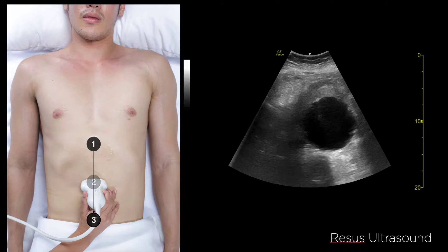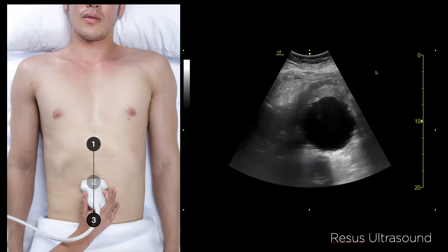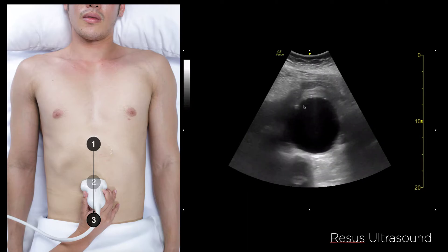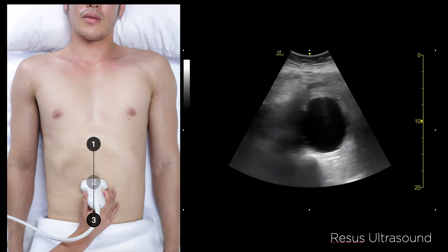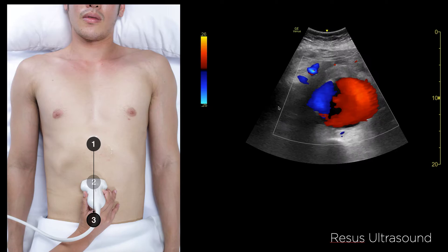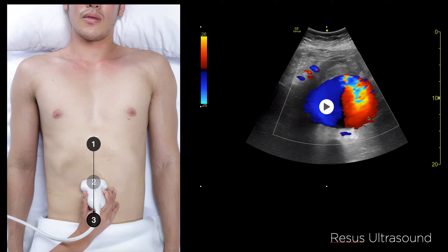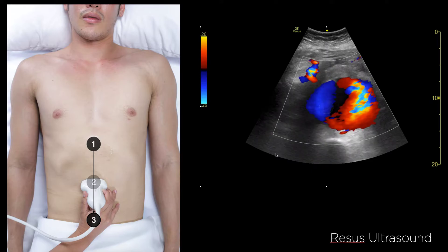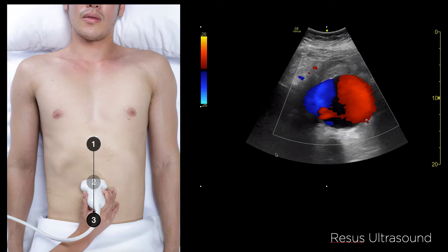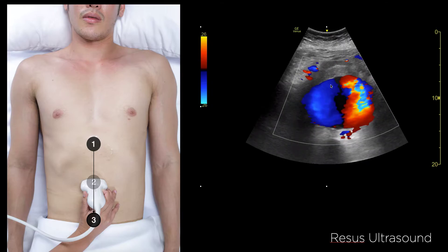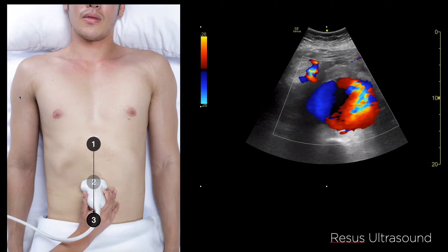Then move down to the umbilicus where normally the aorta splits into the iliac arteries. This is a showcase of our patient who obviously has a large Triple-A. You can see this cystic structure — it's round — and there's something slightly hyperechoic here. When you apply color Doppler, because of turbulent flow, the blood travels in opposite directions, so you see one half blue and one half red. This confirms Triple-A.